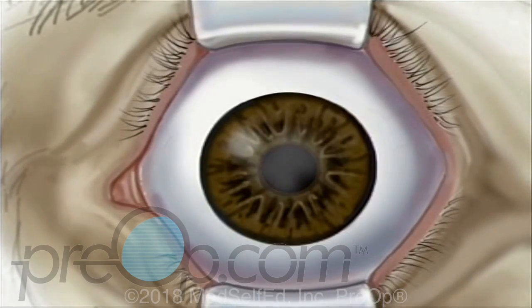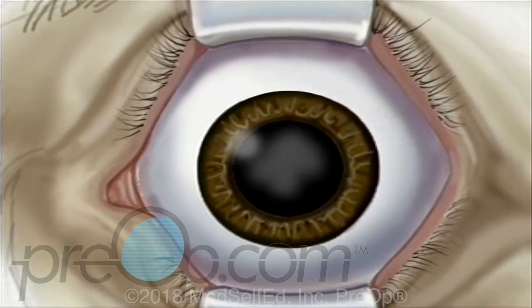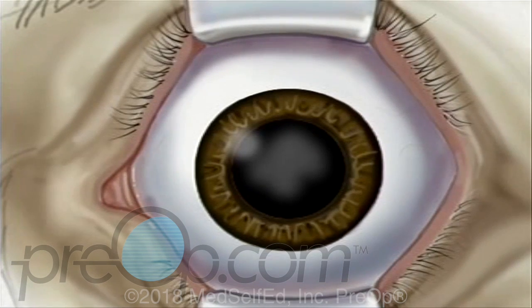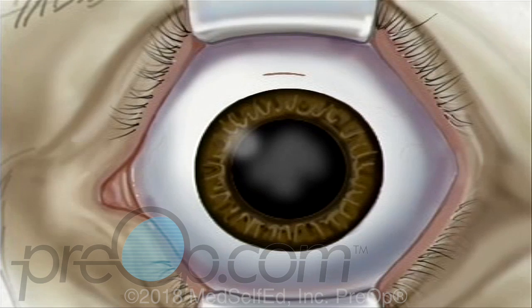By now, the pupil will be fully open or dilated. When the operative field is numb, the surgeon will use the microscope to help make a very small incision, just three millimeters above the iris. The lens is located just behind the iris, contained in the elastic capsule.